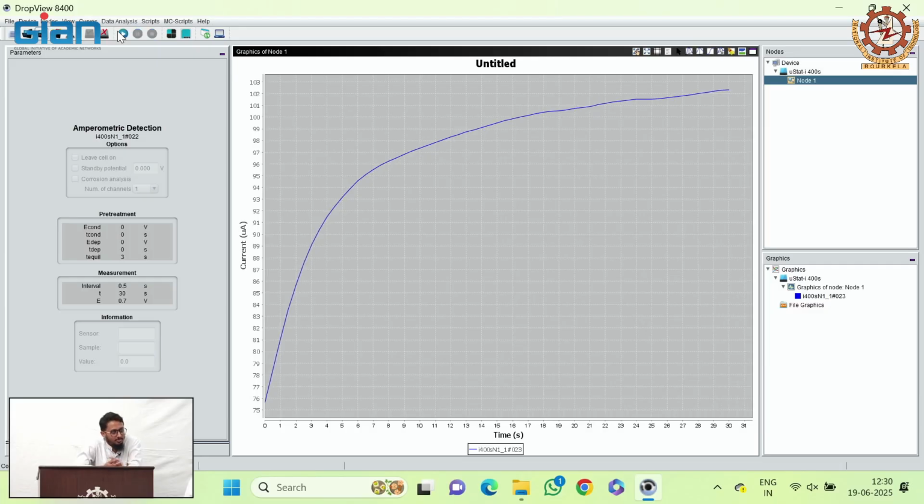So while plotting, you will be using Excel, right? Yeah. Okay. Done. Value 100, 103. Okay. Now we can plot these values in Excel.